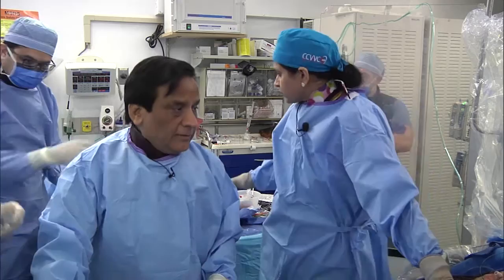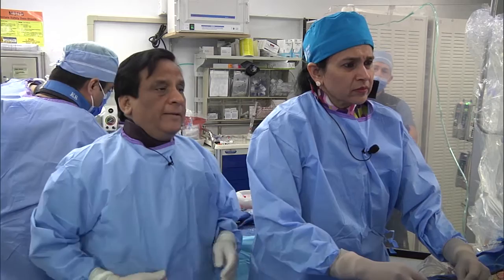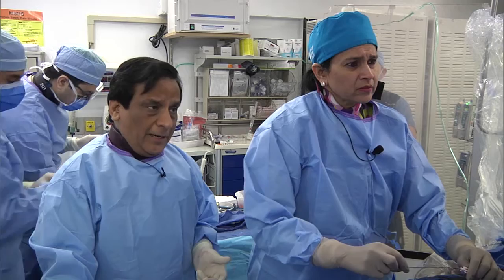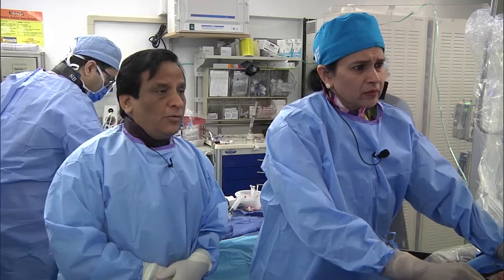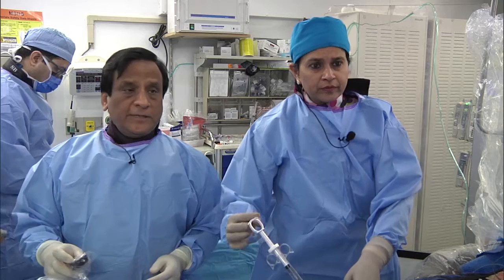We thought this is an illustrative example. Three years ago in the ACC live webcast, we did exactly this kind of case — aortic stenosis with left main and severe three-vessel disease, and we did a balloon valvuloplasty and left main and LAD PCI. This is a replica of that situation. We continue to accrue these cases. We'll discuss the guidelines and appropriateness. While we get ready, we'll briefly go to the slide presentation while Dr. Keeney prepares for the valvuloplasty.